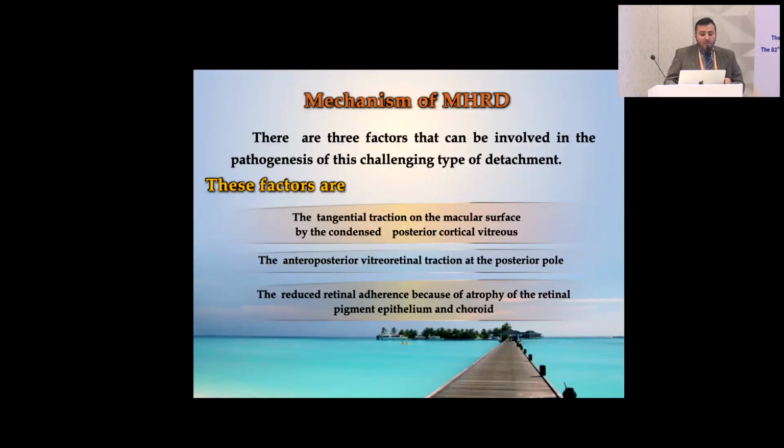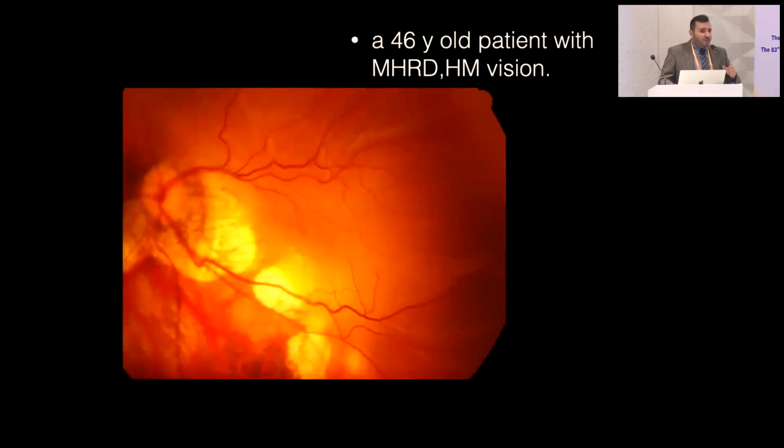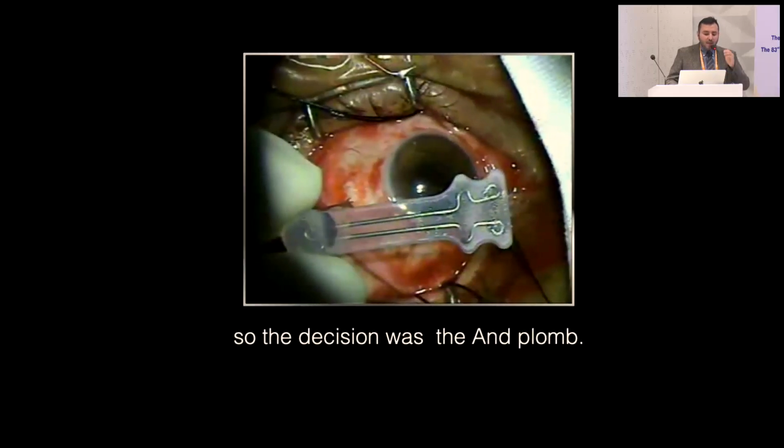The mechanism of myopic macular hole retinal detachment in these cases is due to the tangential traction on the macular surface and anteroposterior vitreoretinal traction and the reduced retinal adherence because of the atrophy of the RPE. So this is the first case in our series, a 46 year old patient with myopic hole retinal detachment due to high myopia. We used in this case what's called the endoplumb, or the macular plumb and the macular buckle.